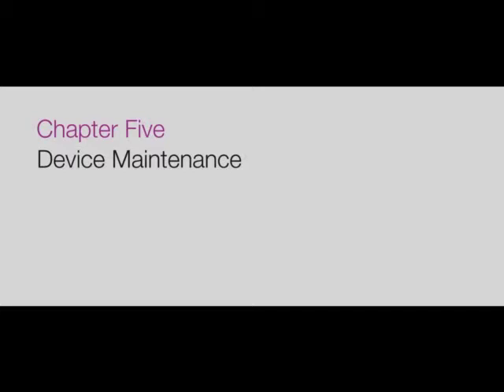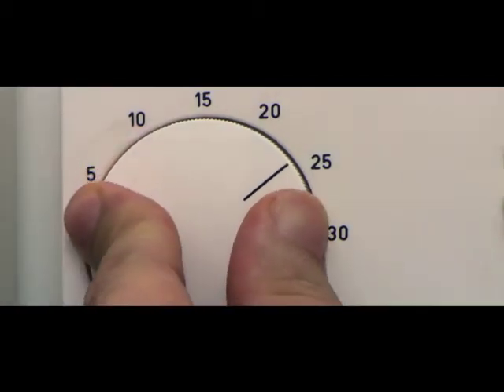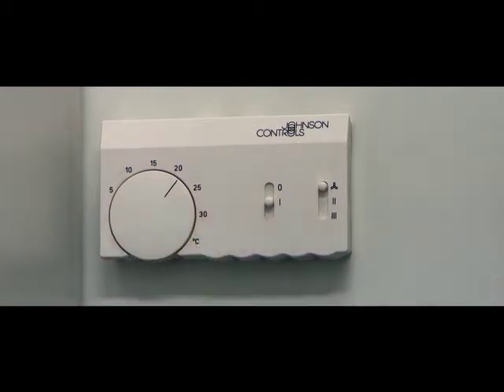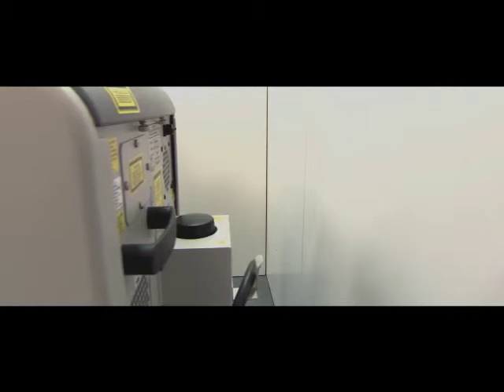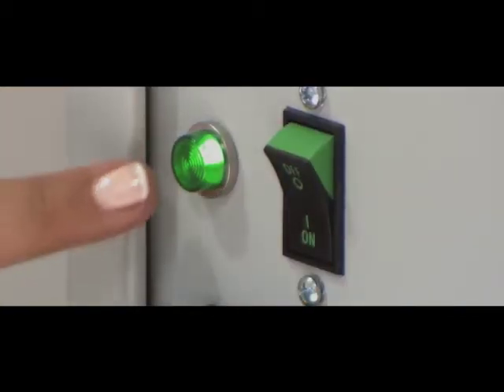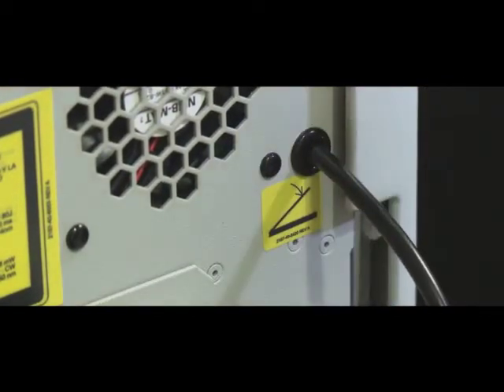Chapter 5. Device Maintenance. The device should be kept in a clean, well-ventilated, temperature-controlled environment. Make sure there is a minimum of 15 inches or 40 centimeters around the device for airflow. In the back of the device, you will find the on-off button, the interlock key, the foot pedal insert, the device filter, and water canister.